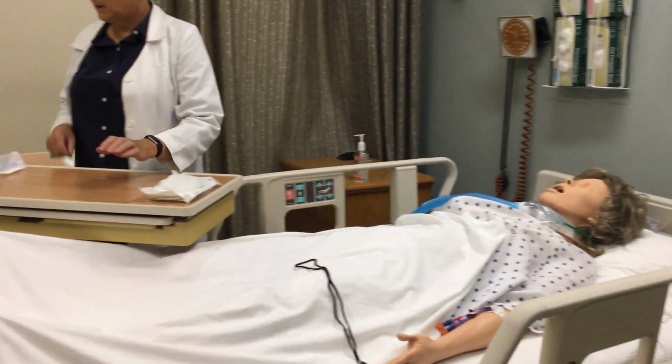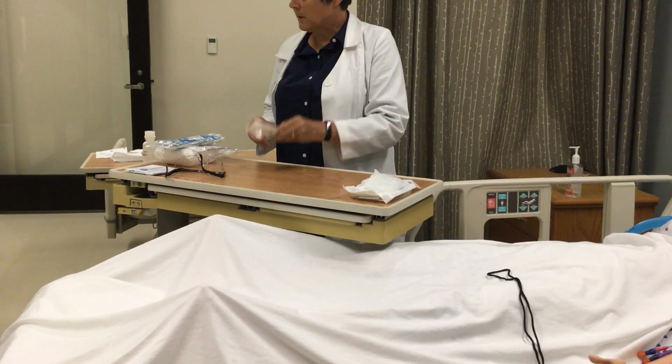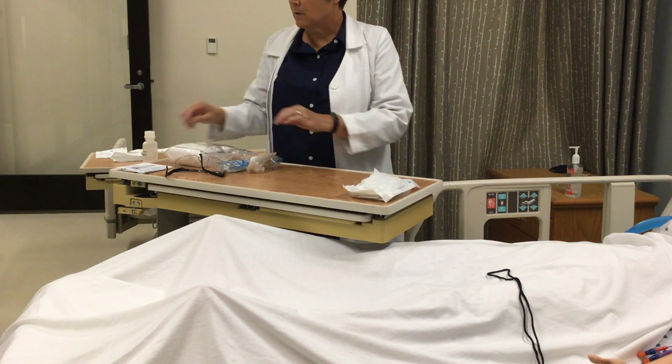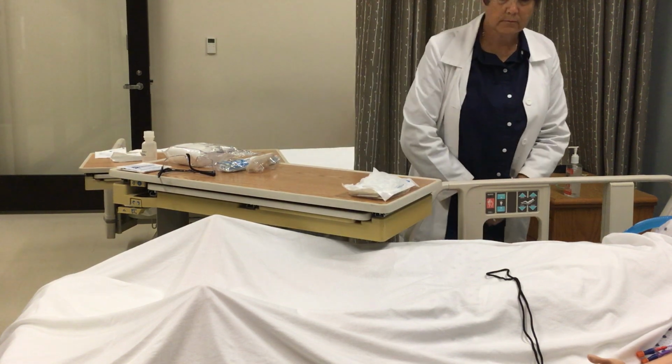Suction kit, clean gloves, disposable inner cannula if that is the case, new ties. I have a kit, I have a spare pair of sterile gloves, and I have goggles for eye protection.